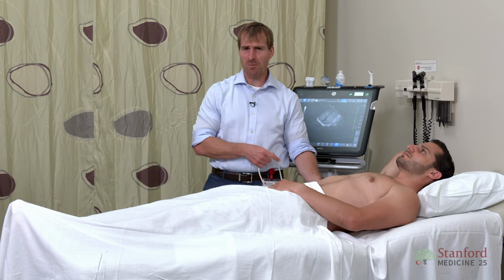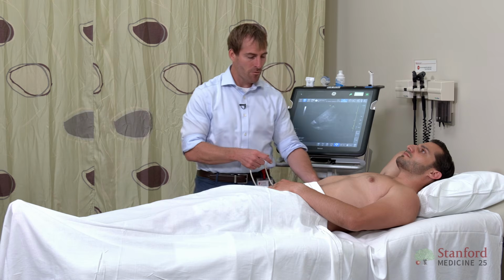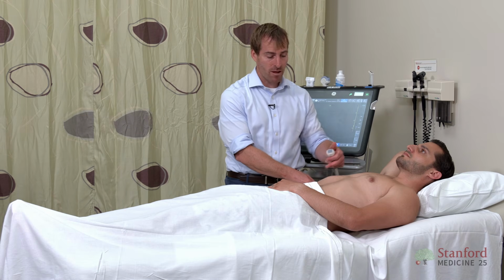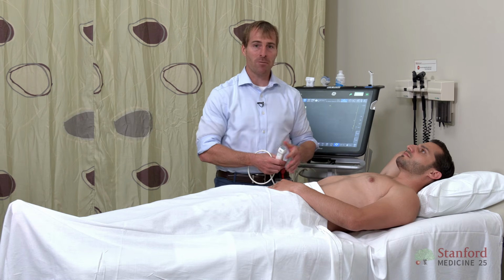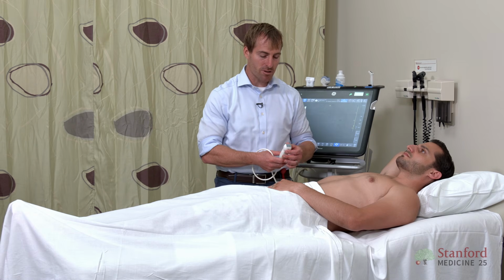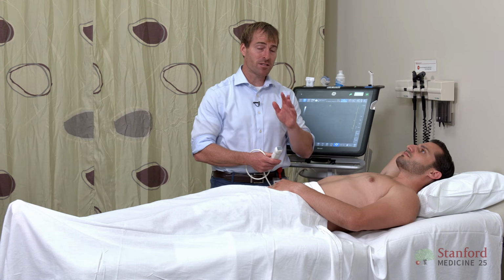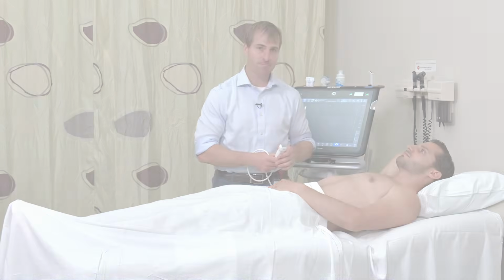Now that's a really pretty picture. Not every one of your patients is going to give you that pretty a picture. Remember, we have a much greater distance between where we're scanning from and where the IVC is. And so if you've got a patient who's obese or just has a very large chest, sometimes their liver might be fatty or fibrotic. It doesn't transmit the ultrasound beam as well. So you could have some problems getting it from this angle, but it does often work, and it's definitely worth a try when you're troubleshooting and you really want to get that clinical information.